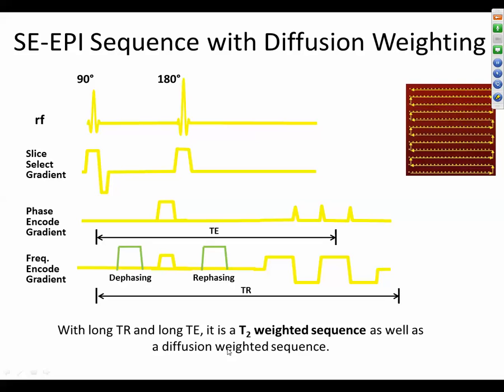When you said that we can apply it to the slice select, phase encoded, or frequency encoded, what does that mean exactly? We can apply the gradients to? Because in the 3D space, we have X, Y, Z. Oh, okay. So each one of those is X, Y. Yeah, these are X, Y, Z, different directions, and the gradient can be applied in either X or Y or Z, and so it measures the movement in that direction.